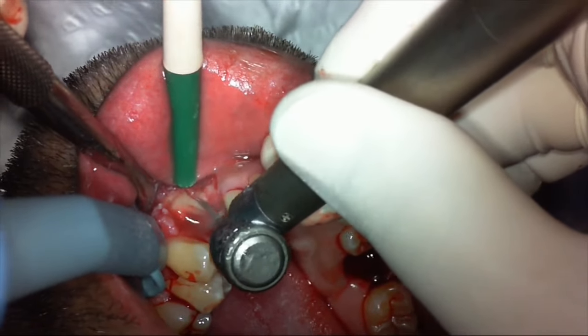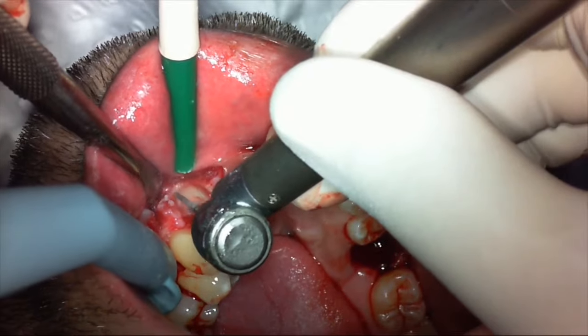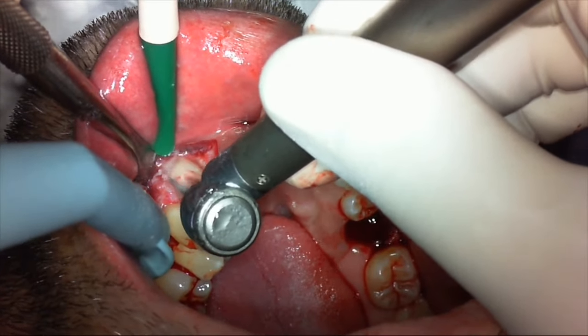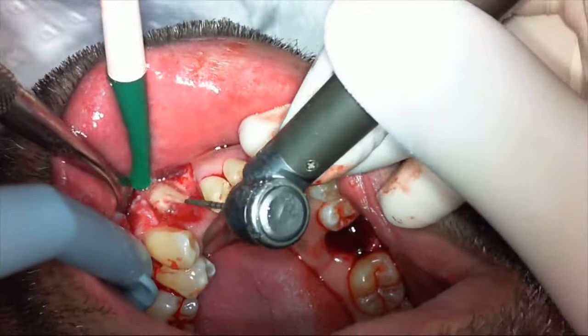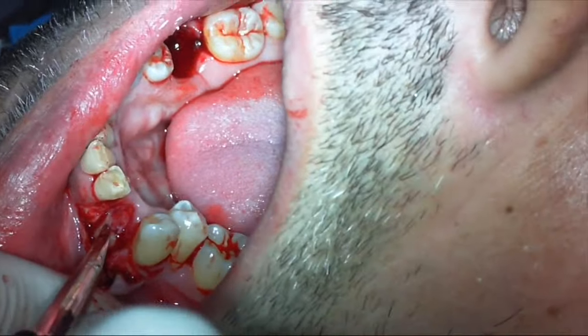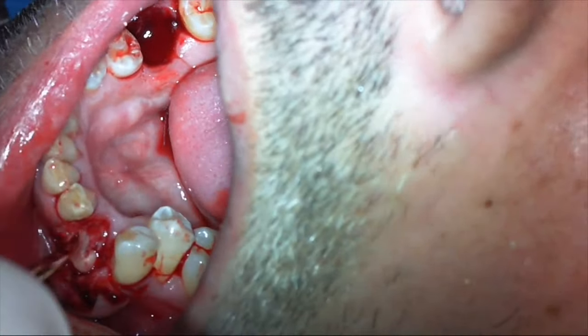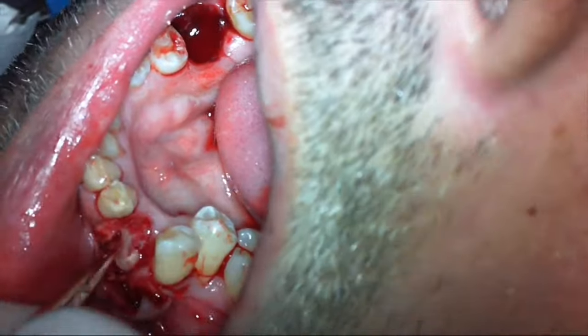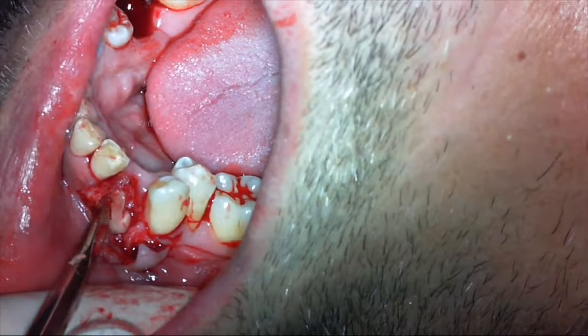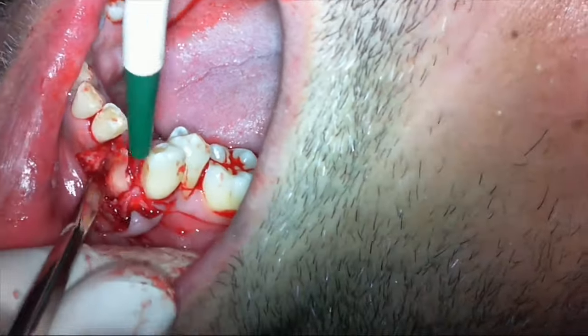That bur is the 700 triple XL. What I like about it is it's very long and very thin. I'm using it to remove some bone on the mesial and distal, then using my luxator — I prefer luxators over elevators — to elevate the two roots in one piece. The handpiece has a 45-degree angle, keeping it away from the field of view.